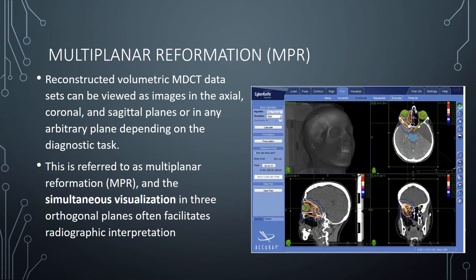When you open CT data, whether multi-detector CT or CBCT, the display interface is called multiplanar reformation. It is reconstructed volumetric data that can be viewed as images in the axial, coronal, and sagittal planes — essentially the x, y, and z axes — or in any arbitrary plane depending on the diagnostic task. This ability to view multiple planes simultaneously improves diagnosis considerably.